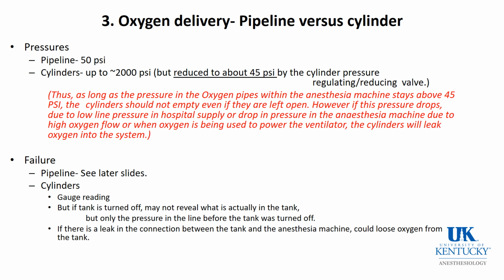But if the tank is turned off, many of the machines won't show that tank pressure. However, the modern anesthesia machines will typically show the tank pressure, and furthermore, when the pipeline pressures fall, it will alarm.